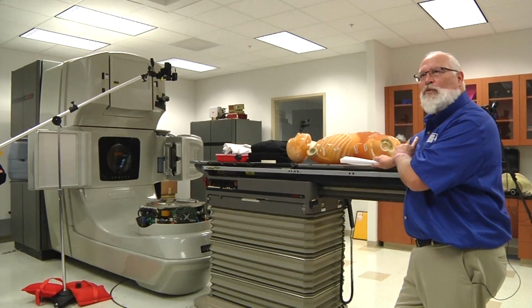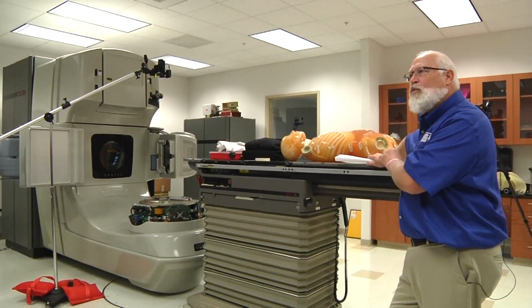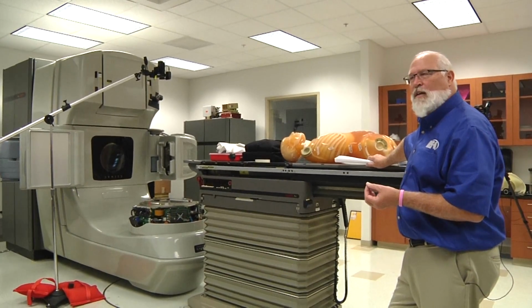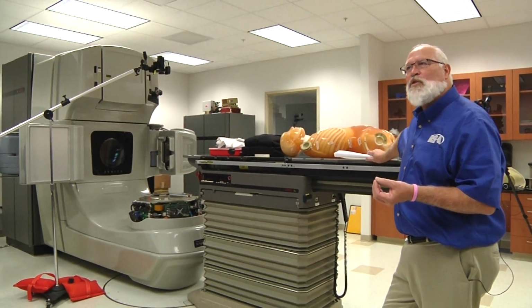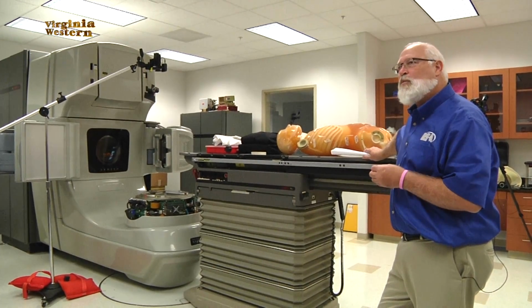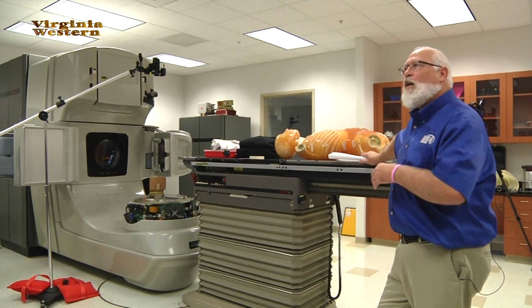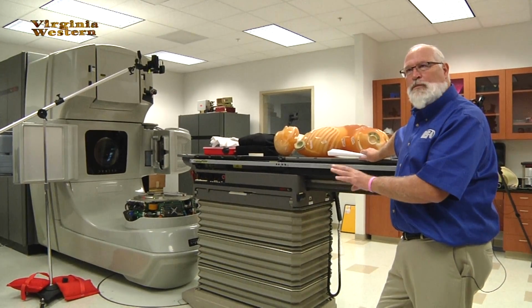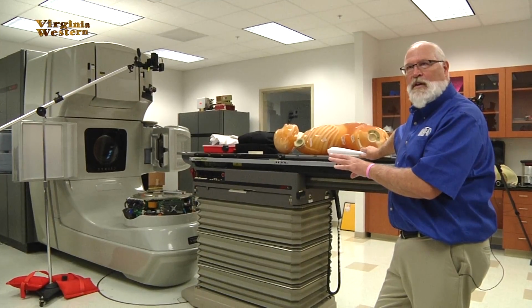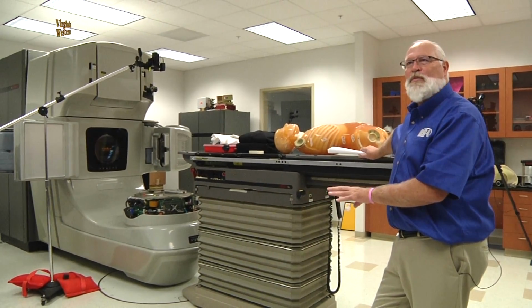Let's go back into the room and we'll go through some of the checks briefly. Then I want to go through some of the QA checks that Varian recommends that your physicist needs to check before you're allowed to use the machine for treatment. A lot of times we'll write you a note because physics must approve our service before you treat on the machine.